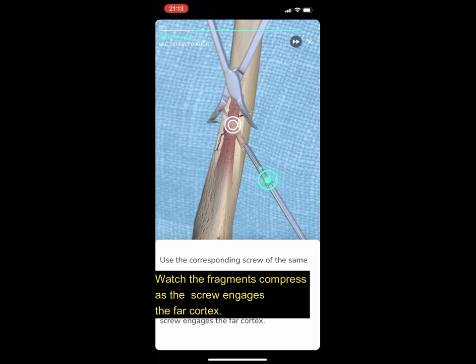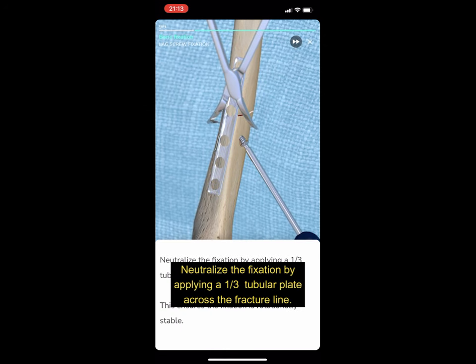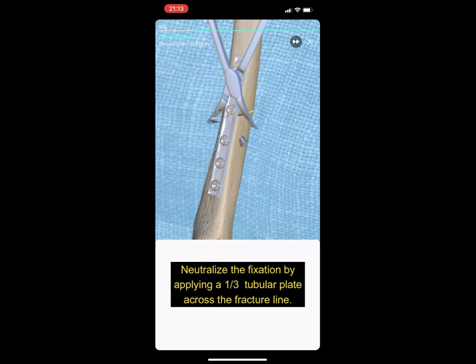Watch the fragments compress as the screw engages the far cortex. Neutralize the fixation by applying a one-third tubular plate across the fracture line.